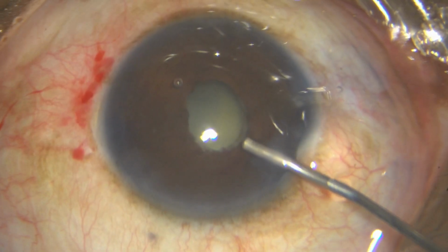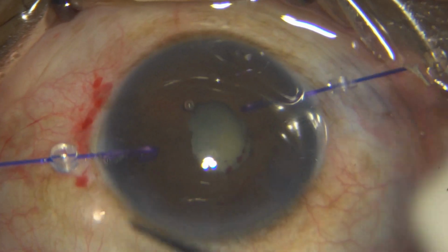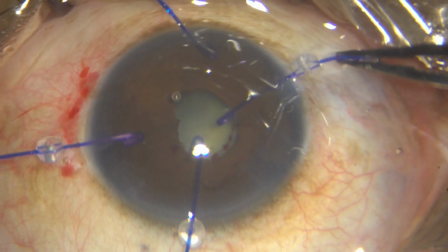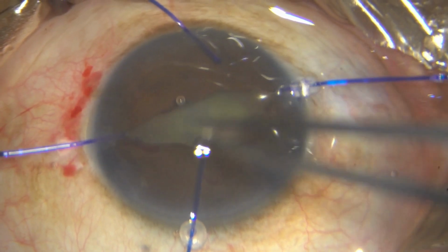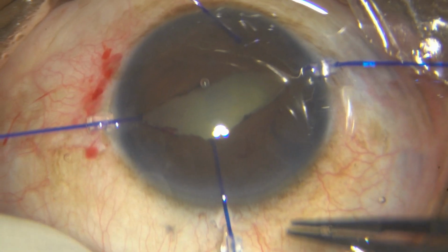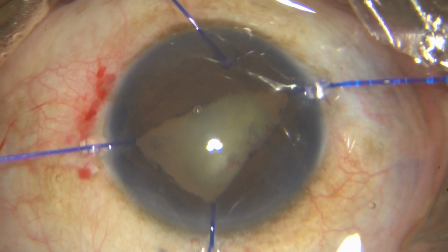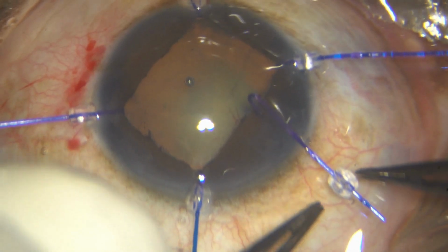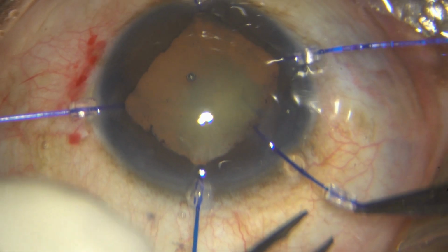And iris hooks are a good way to handle a pupil with a fibrotic membrane. You can't do it as efficiently as iris hooks with other devices. So here I am putting the iris hooks, and you can see it is a pretty dense cataract. She happens to be a diabetic as well, so I expect a leathery cataract. I put one extra iris hook through the main incision to give me more space.